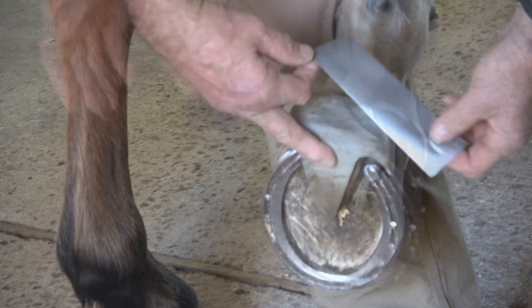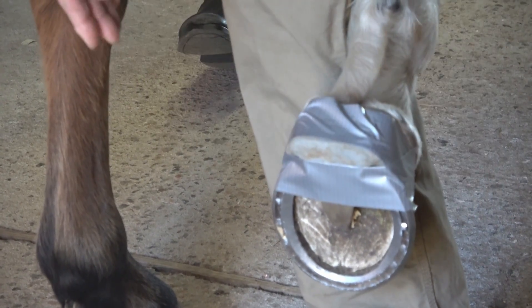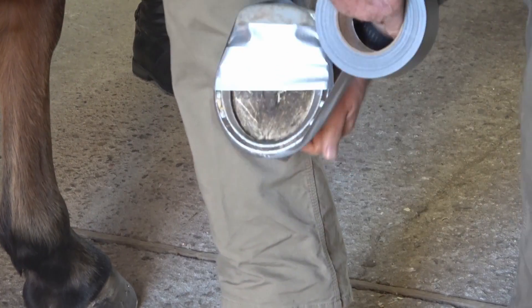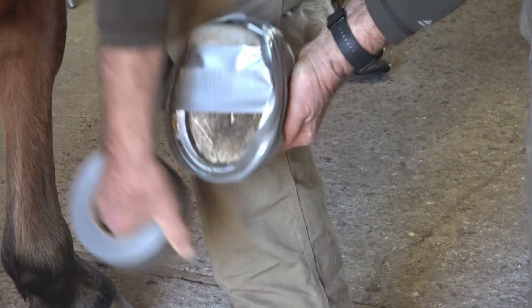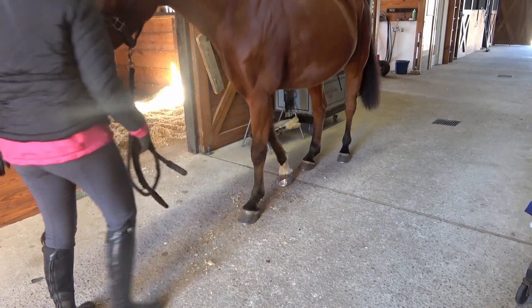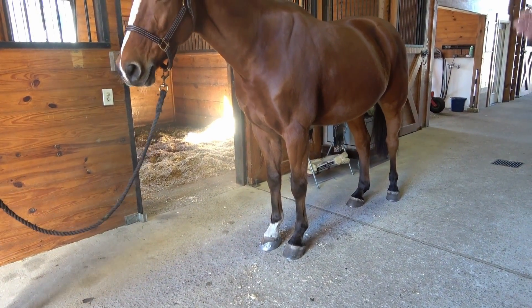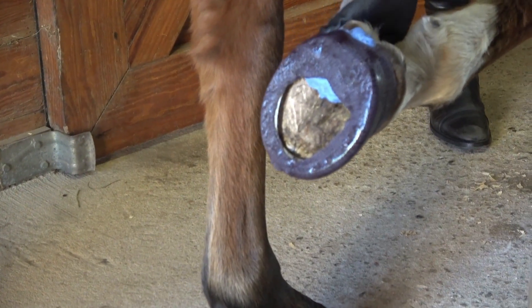There may be times during a shoeing cycle where the addition of some frog support or just better caudal support and stability may be warranted. You've done some preliminary testing with taping on a temporary frog support, and the horse moves better and stands more comfortably, and you would like to offer that support 24-7. Casting sole support impression material into the rear portion of the foot is a great option.